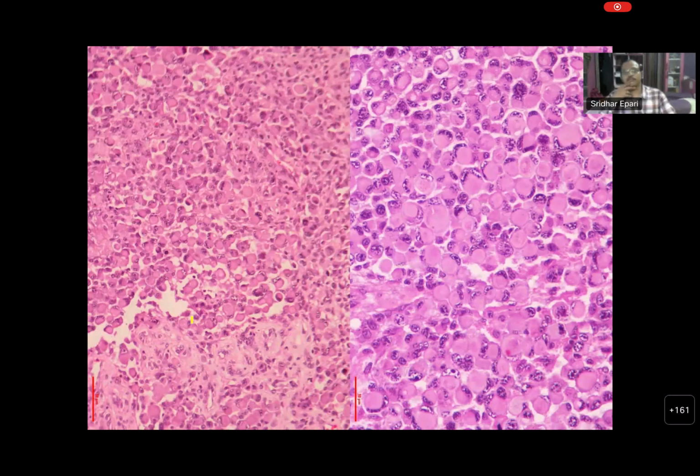How do you describe the H&E section showing this? Yes, sir. Tumor cells which are round to oval. It's a very cellular lesion. Absolutely no normal cells you're seeing. You can see that they're quite discohesive. Now we describe the cells. They are round to oval with eccentrically pushed pleomorphic nuclei showing irregular chromatin with abundant eosinophilic cytoplasm.